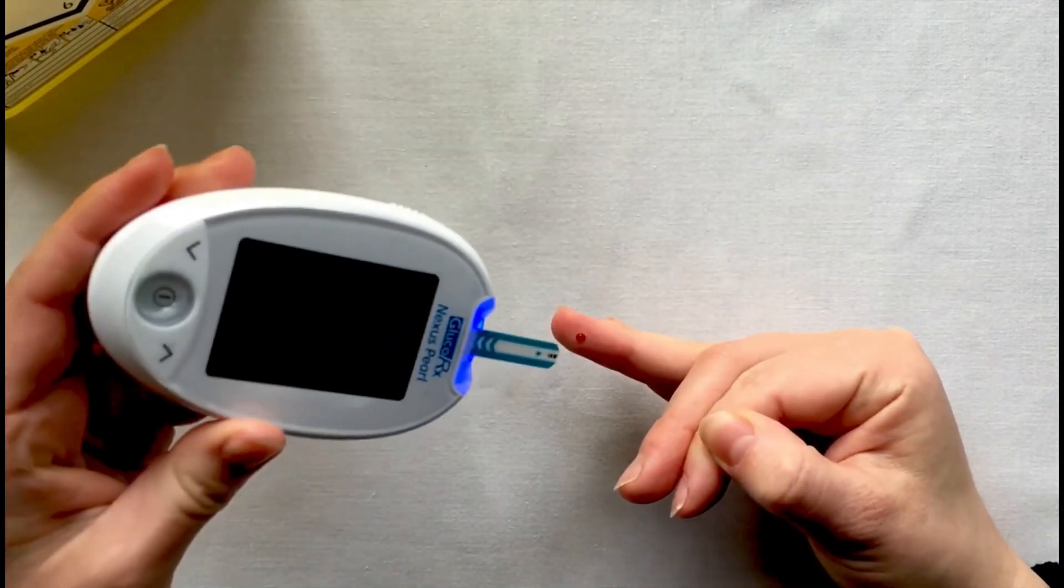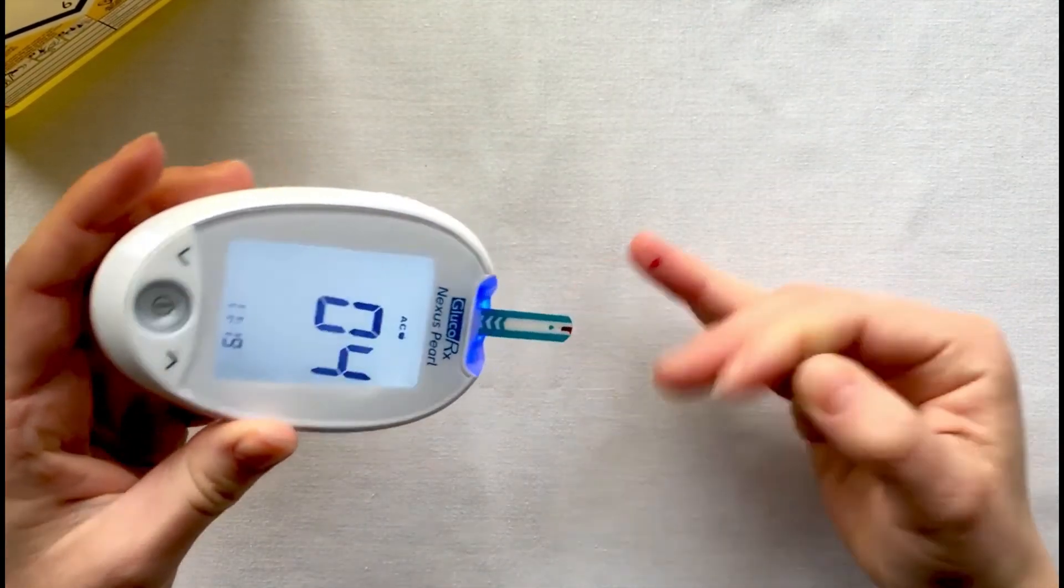Hold the end of your test strip to your finger at a 45 degree angle. Your blood sample should be drawn into the strip.